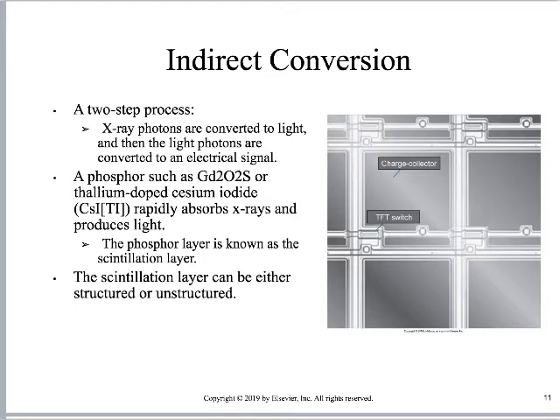So that two-step process is significant because, like Ms. Thorne indicated, we are going to lose some information just in the process of turning the X-rays into light. That's why we're going to spend so much time talking about this, what we lose. So we will use a phosphor, a scintillating phosphor. What does that mean? In response to X-rays, it emits light. That's what a scintillating phosphor does. And this goofy chemical here is gadolinium oxysulfide. Gadolinium oxysulfide. Or we'll use thallium-doped cesium iodide, right, to absorb X-rays and produce light. One of them's better than the other, but one of them's also more fragile than the other.